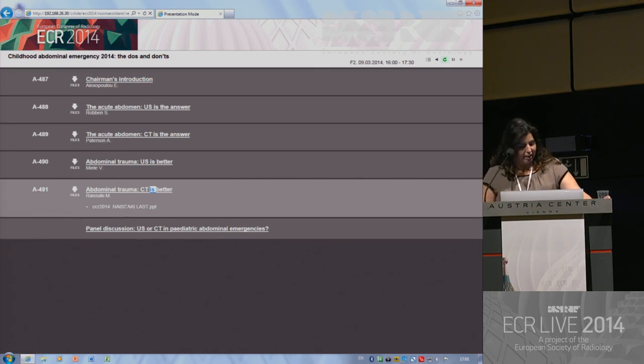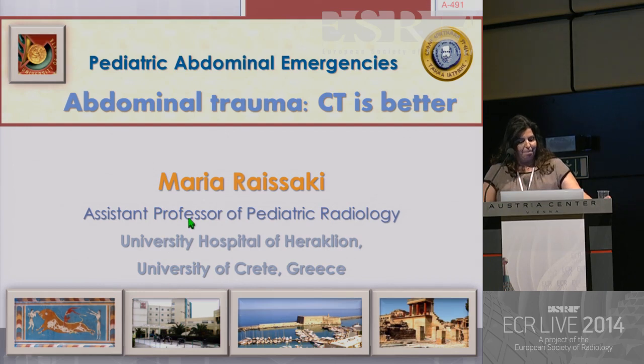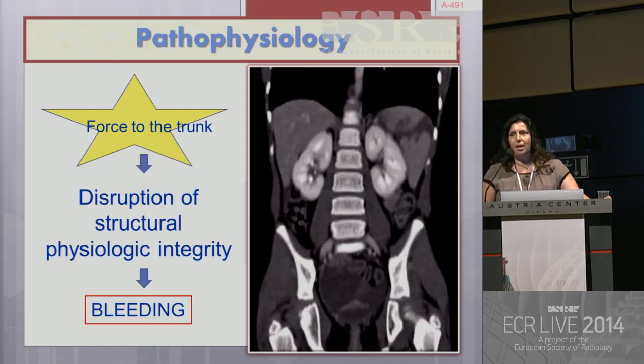Dear colleagues, it is an honor and a privilege to be invited to discuss CT in pediatric abdominal trauma. When I undertook this task, I thought, okay, most of the people in the room will do CT for severe abdominal trauma, so my task is easy. But I would like to give you some new facts and some thoughts for consideration and discussion.